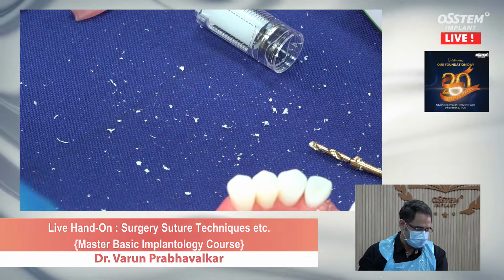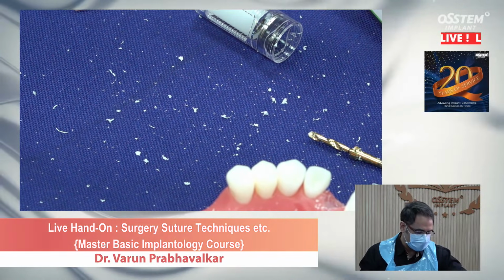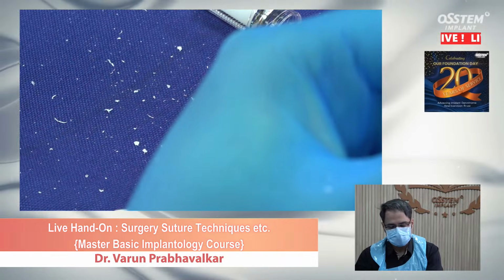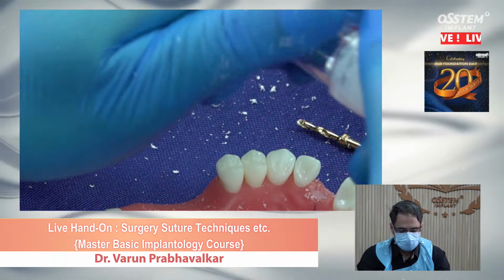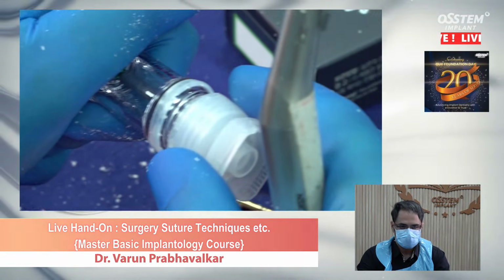The implant which I have right now is a mounted implant, which is a little different implant than the no mount, as it exhibits a mount. And it's a design which I usually prefer.